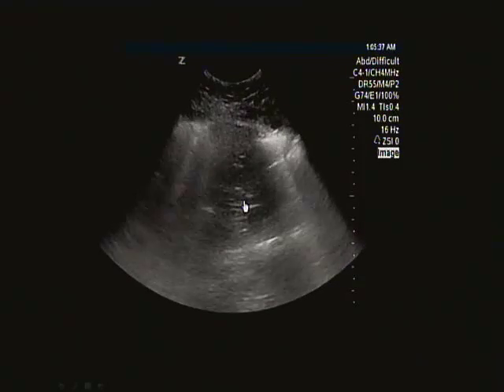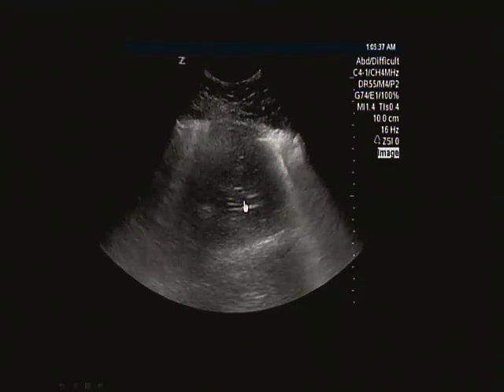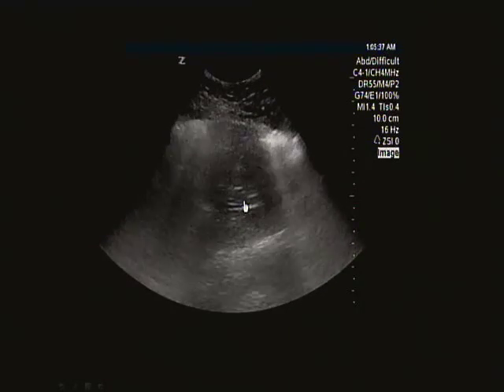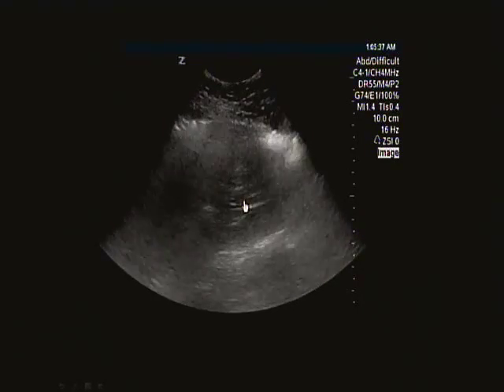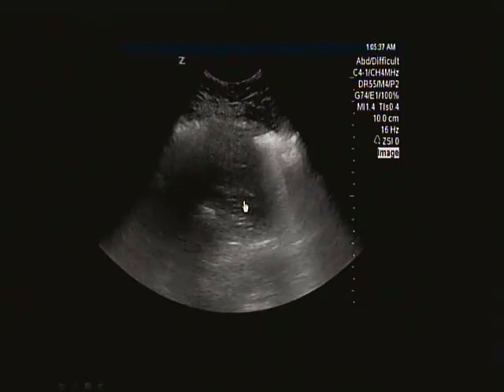Okay, so here is a patient we had, and you can see here's a bunch of B lines, right? So there's all this wetness. There's a little bit of lumpy, bumpy pleura over here. But underneath this is something weird, right? Usually if you have a skip area, you're not going to see these little bronchi, and I'm in the chest, at the fourth or fifth intercostal space.